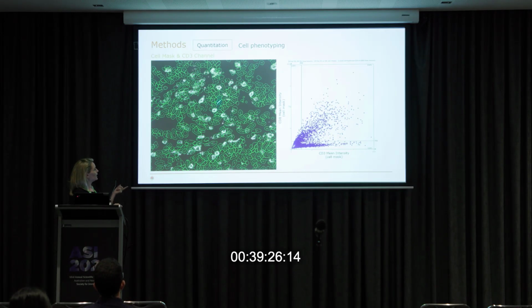You can right-click on any one of these cell masks and say, show all the data, and it will show you every bit of information. You can look at mean intensity. You can look at the 75% upper mean, like the brightest 25% pixels or the brightest 50% if you want to ignore it if it's a very big area. And you can look at the size as well. You can look at the fluorescence intensity, just kind of look at the brightness.